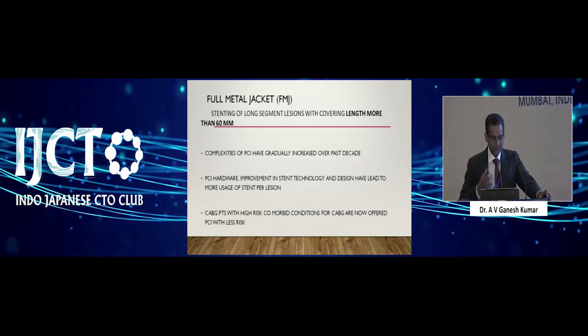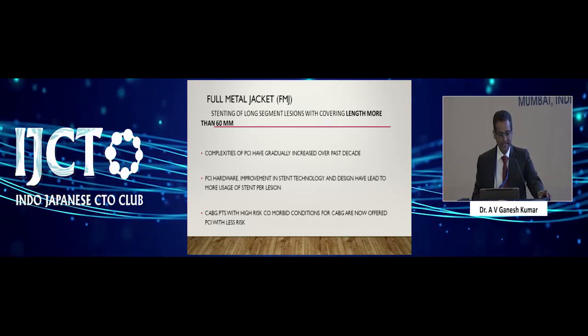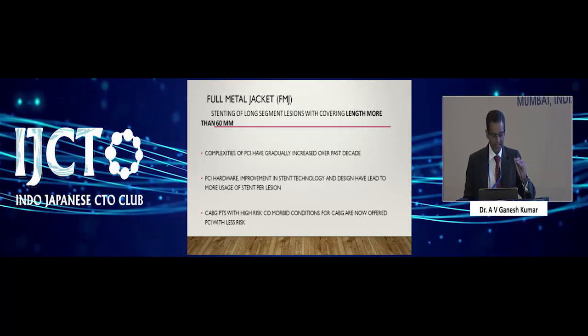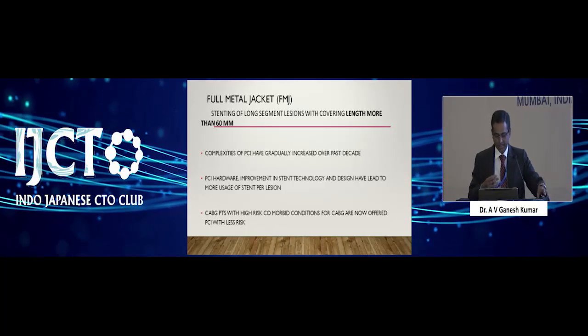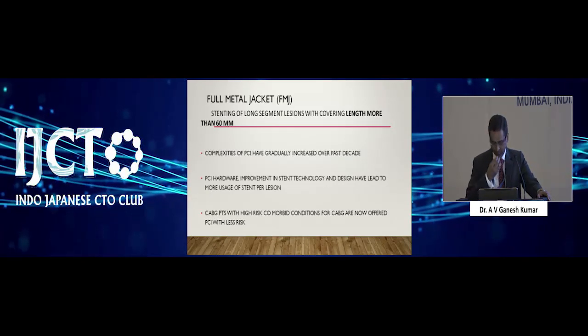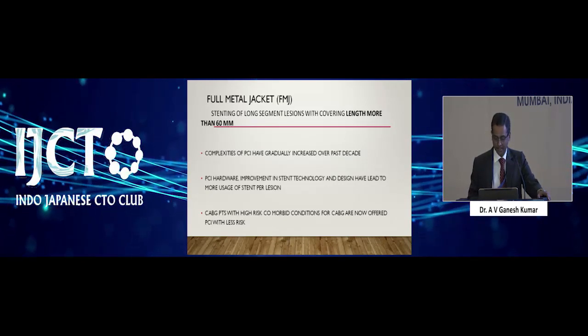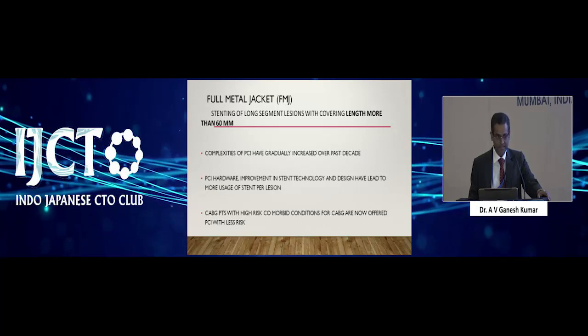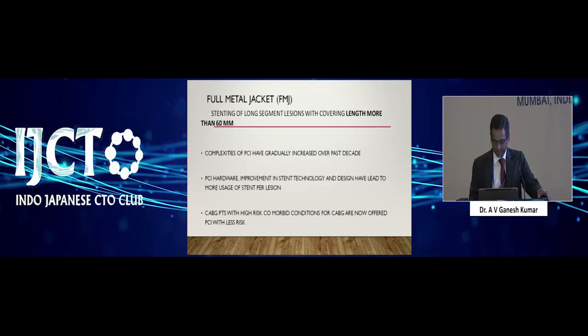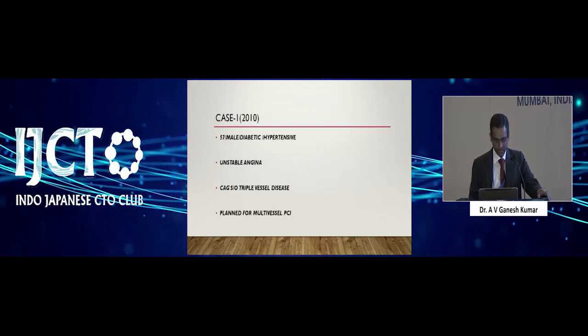So the complexities of PCI over the last decade have obviously seen a tremendous growth in full metal jackets. Initially, in the beginning of the decade, or even 5 years back, we were very skeptical about using full metal jackets, and we would criticize our colleagues saying that, oh, this patient will come back with restenosis or MACE rates. So let's see what our talk is going to be on.